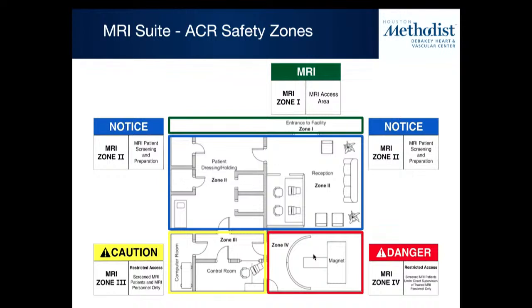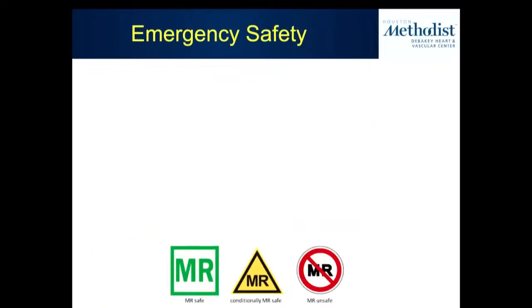All right. Are these lead doors between the zones? Yeah, these are specially shielded doors. There are two purposes. One is to try to reduce the magnetic field, but also importantly to prevent radio waves from going in and out. Remember we talked about earlier, the radio waves are how you transmit and receive signal. So you don't want radio waves from your phone or from a radio station corrupting your image. That's why there's special shielding for these rooms to prevent radio waves from going in and out. Okay. It's not lead. It's a slightly different type of shielding, but there's a special shielding in place.